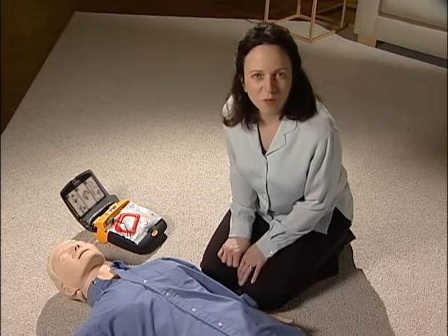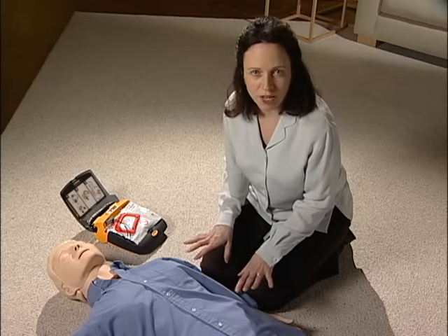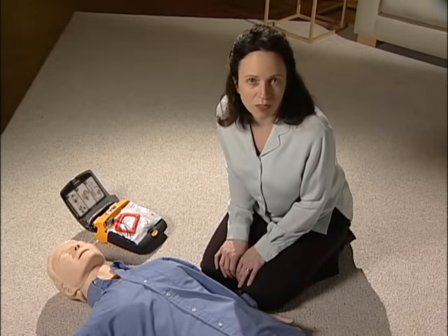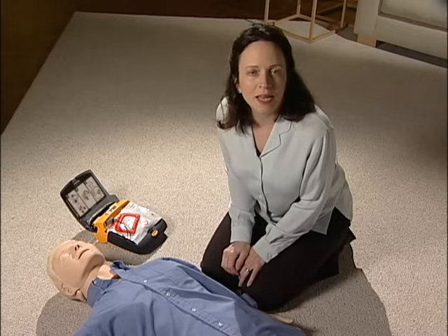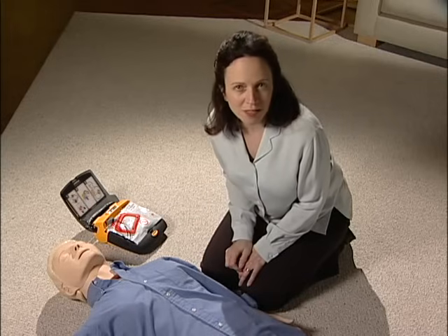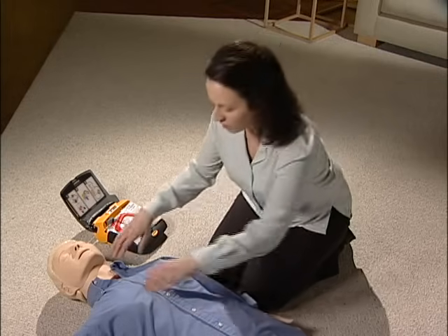You've already called 911, so start getting the clothes off their chest. Do whatever you have to do to clear the clothing quickly. Lift it, tear it, or cut it off. Don't waste time being nice to the clothes. Some versions of the LifePak AED come with a kit that has a pair of scissors, but in this case, the fastest way is to just tear open the shirt.